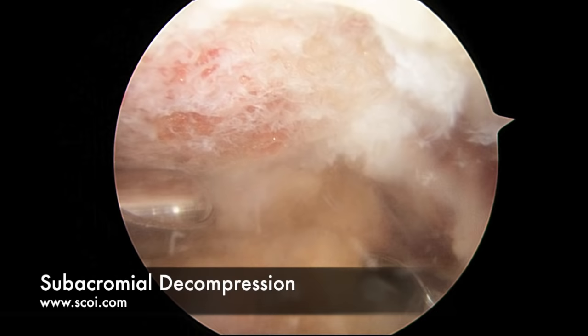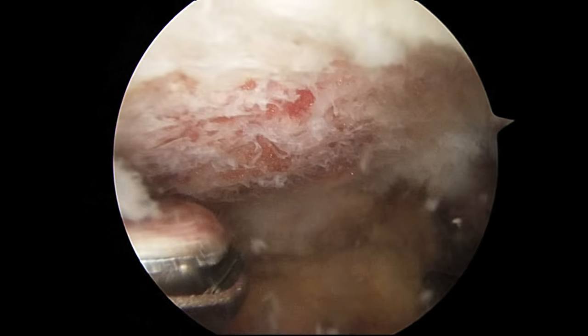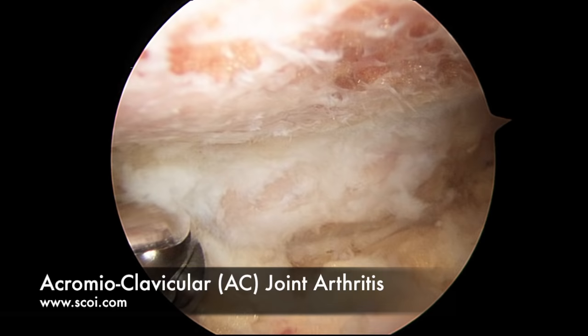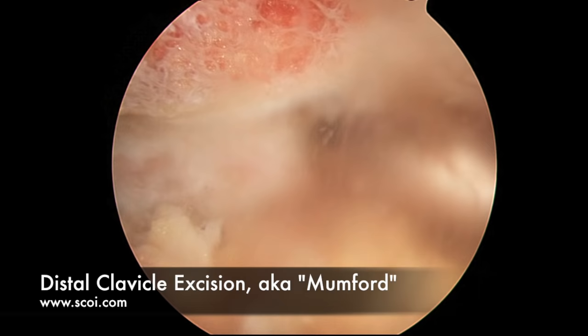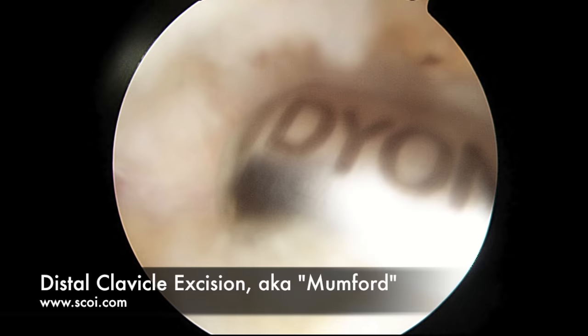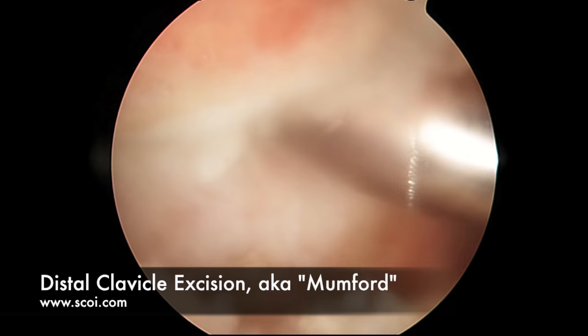This patient also has something called acromioclavicular joint arthritis or AC joint arthritis. The end of the collarbone is right over here, and this area has been quite painful — it does not have a lot of cartilage functioning on it anymore and it is quite tender. So we're going to perform what we call a Mumford procedure, which is an excision of the distal one centimeter or so of the clavicle. For a distal clavicle excision, we use the same shaver and slide it in between the acromion and the clavicle, and work our way across until we remove about 10 to 12 millimeters of bone. This prevents the two arthritic surfaces from banging together and causing pain.